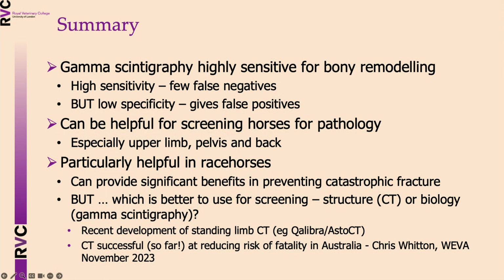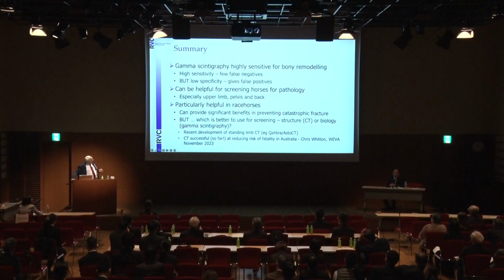We believe it can provide significant benefits for preventing catastrophic fracture.